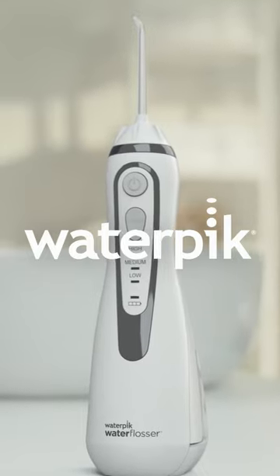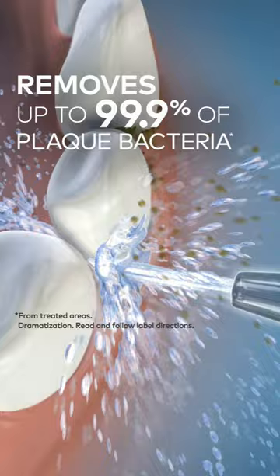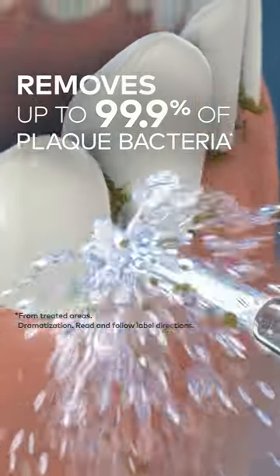Adding a Waterpik water flosser to your daily oral care routine can be exciting. I'm talking pulsating warm water. Cordless Advanced cleans deep, removing up to 99.9% of plaque bacteria.